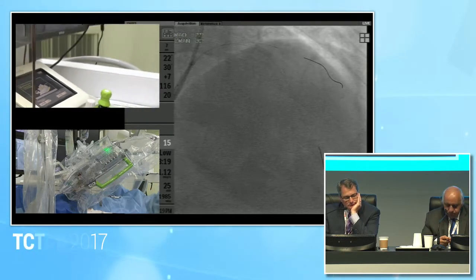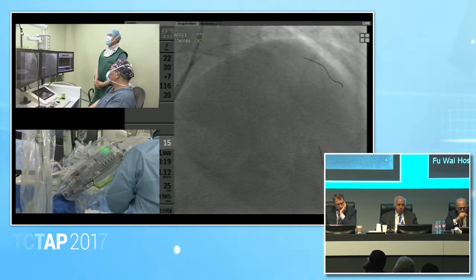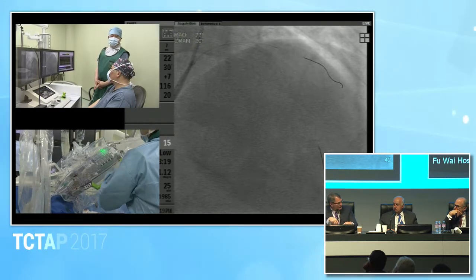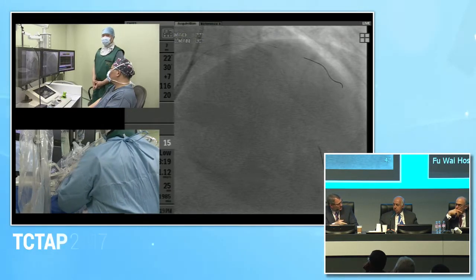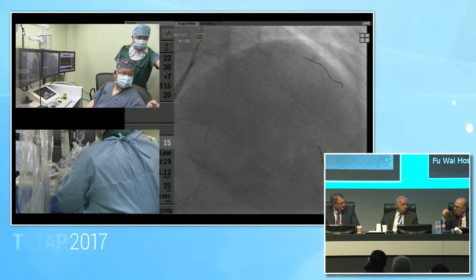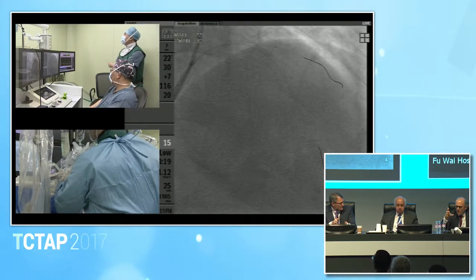So, Aaron, when he set this up, he put two wires into it initially? Mm-hmm. So you advance one wire to the target. You take that out of the drive track. You lift up the cassette top. You pull that out of the cassette. You park it. You insert the second wire, and then you drive that robotic. So first one goes in, gets set, parked. Yep. The second wire then goes in. Correct. So you have to go in there, or your assistant does all that.